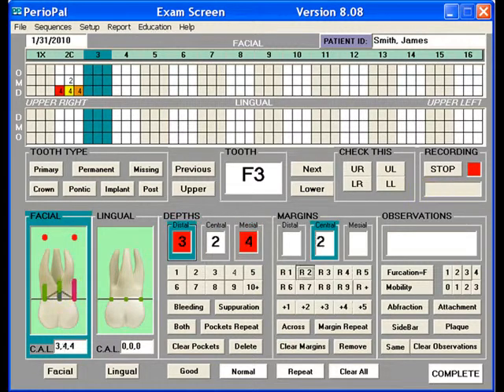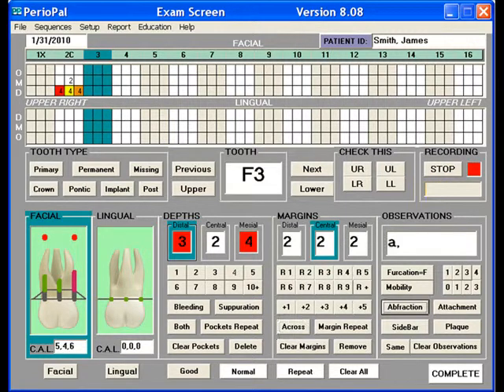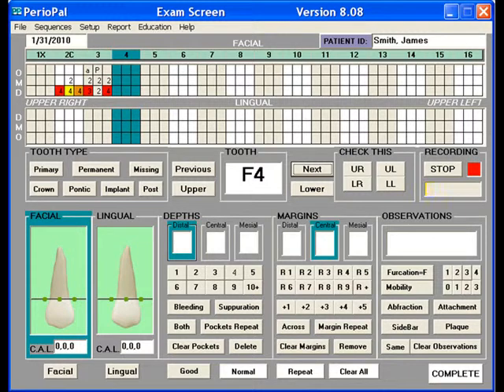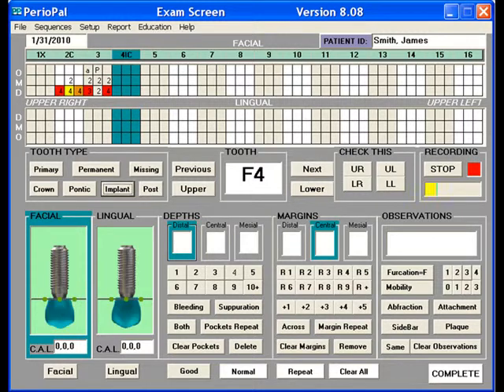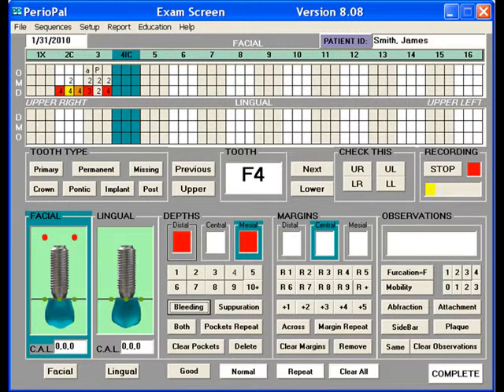Across. Abfraction. Plaque. Next, 4. Implant. Bleeding. Mesial. Bleeding. Mobility, 1. Plaque.